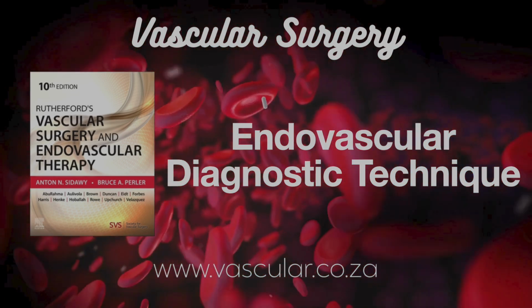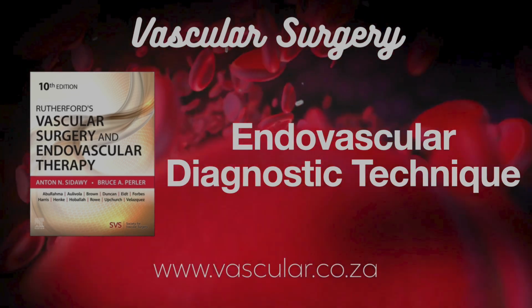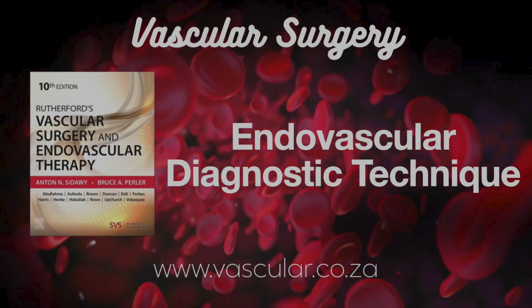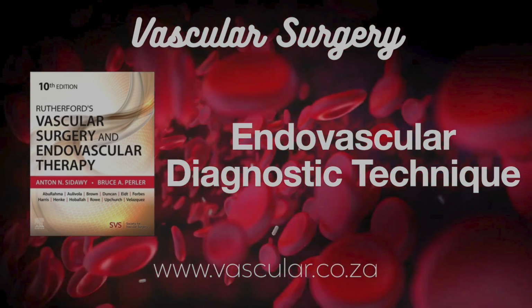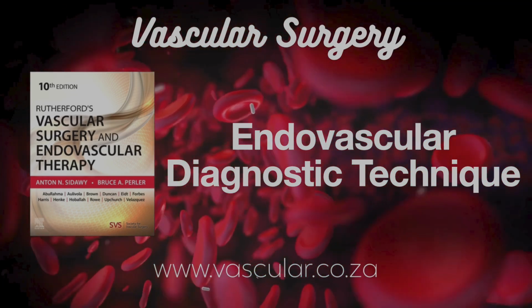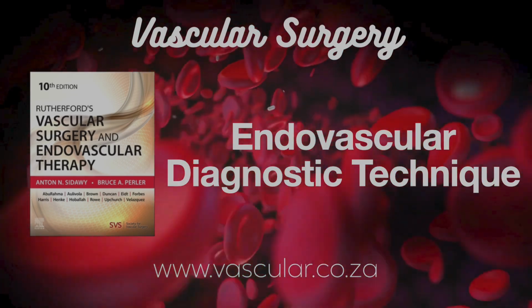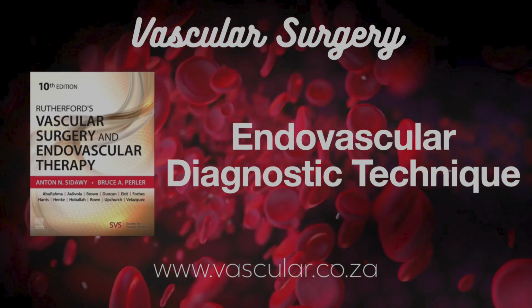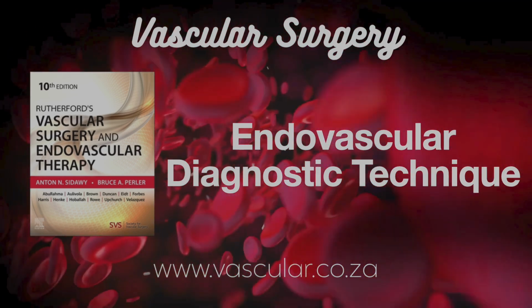Right. Air embolism. Okay, let's run through common venous sites. Common femoral vein. Very common, just medial or inside to the CFA. Used a lot for procedures in the vena cava or its branches, like investigating pelvic congestion syndrome. Compresses easily against the femoral head. Ultrasound useful? Often used, yes, to make sure you hit the vein and not the artery right next door. You can also cross over to the other leg's veins from here, though navigating valves takes some skill.